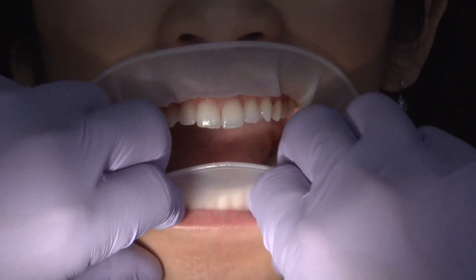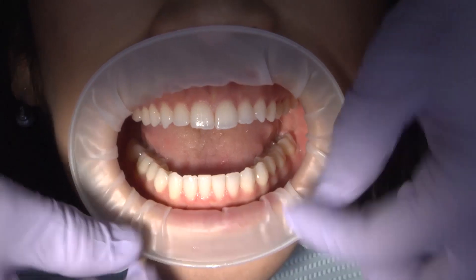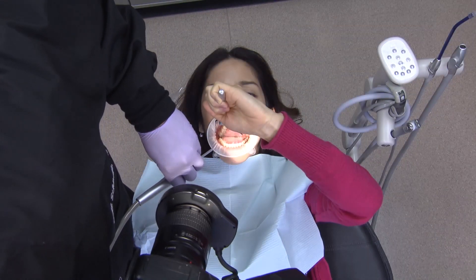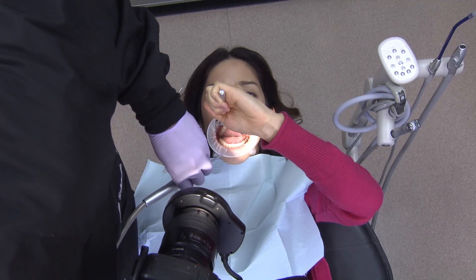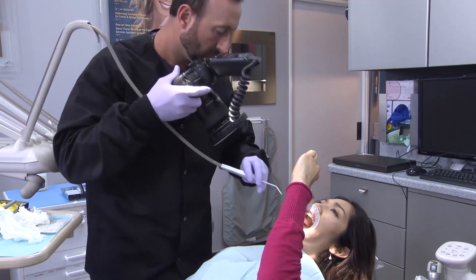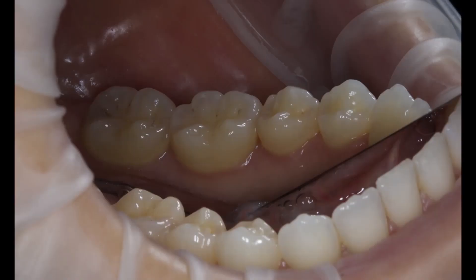Secondly, I'm going to take this series of photos of number 30 with the patient's overhead light directly shining into the mouth. I'm doing this to show the difference that an appropriately focused ring flash connected to the camera can make versus using artificial room illumination. Even though we have achieved superior retraction with the OptraGate, notice that the exterior light causes shadowing and a blurry dark effect on the reflected images. Trust your ring flash and the settings on your camera and use this in addition to any natural ambient light in the room to capture professional photos.